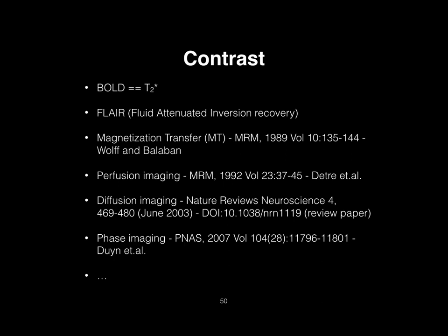And so I lumped this in with a bunch of others, but are there any questions before I run through some of these final bits? Okay. So that mechanism there is the basis of BOLD. It's blood oxygen level dependent contrast, and it comes from the fact that when that bit of tissue becomes active, now your oxygenation level goes up, and essentially that causes the signal to go up as well.